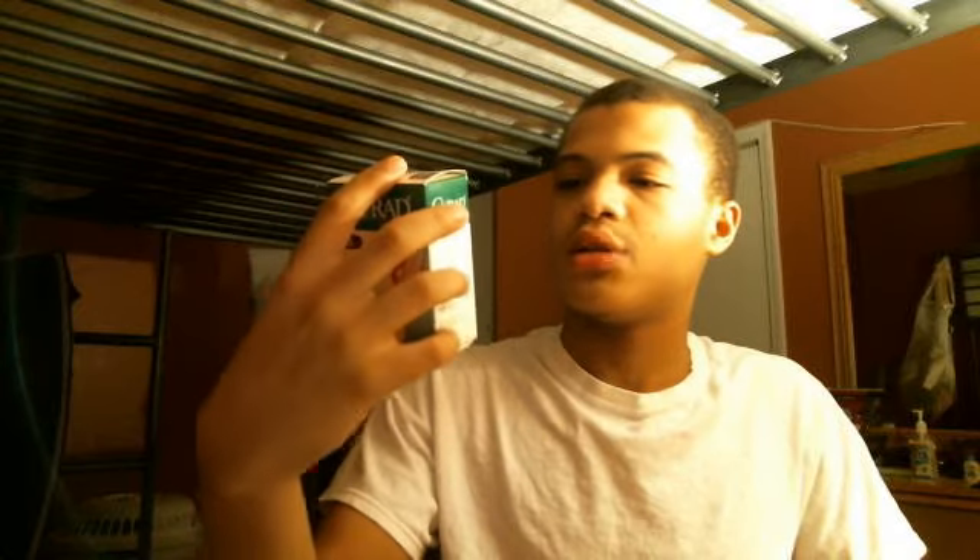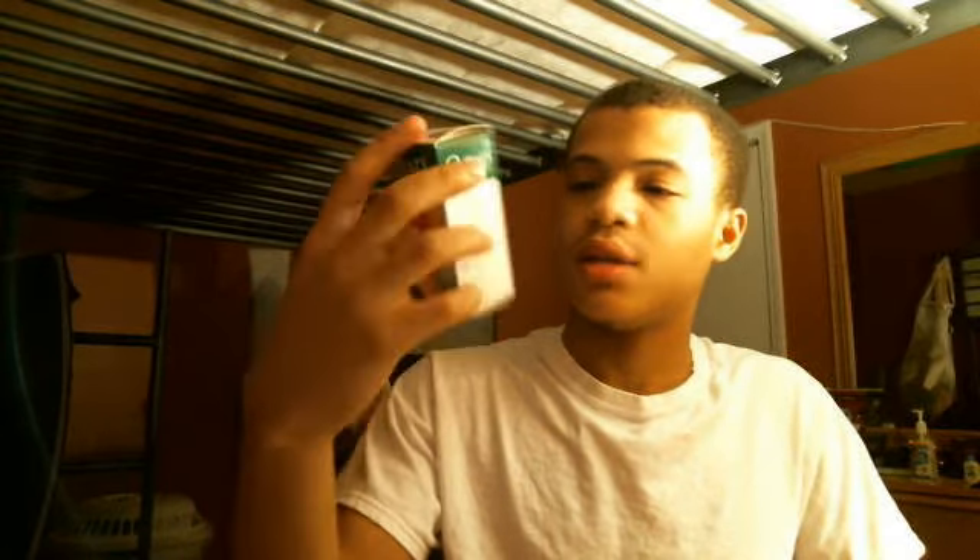What's up everybody, this is AT3, the best. Today I'm going to talk about Currad band-aids.